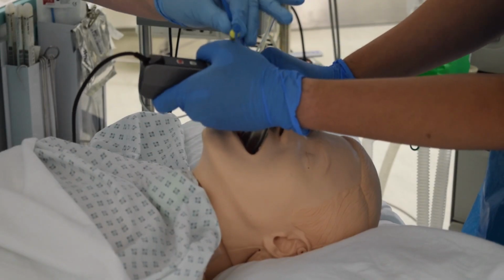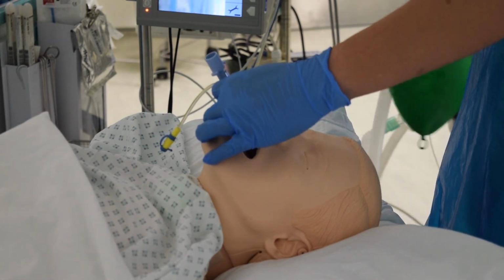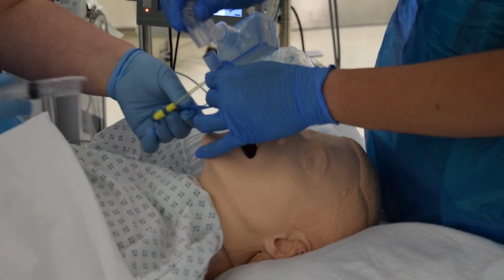If non-invasive ventilation is inadequate or not felt appropriate, then invasive ventilation is the advanced respiratory support that can only be supplied in a level 3 area. In a select group of patients who fail to be adequately oxygenated with invasive ventilation, extracorporeal life support or extracorporeal membrane oxygenation, also known as ECMO, may be an option.